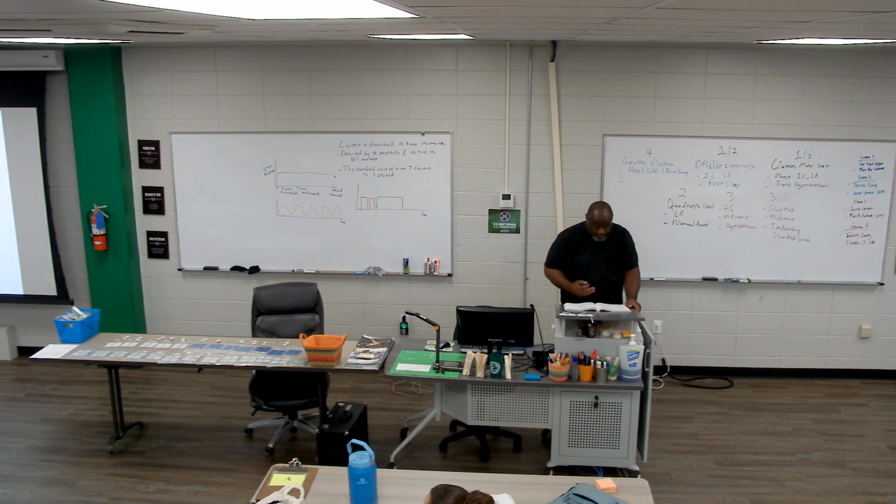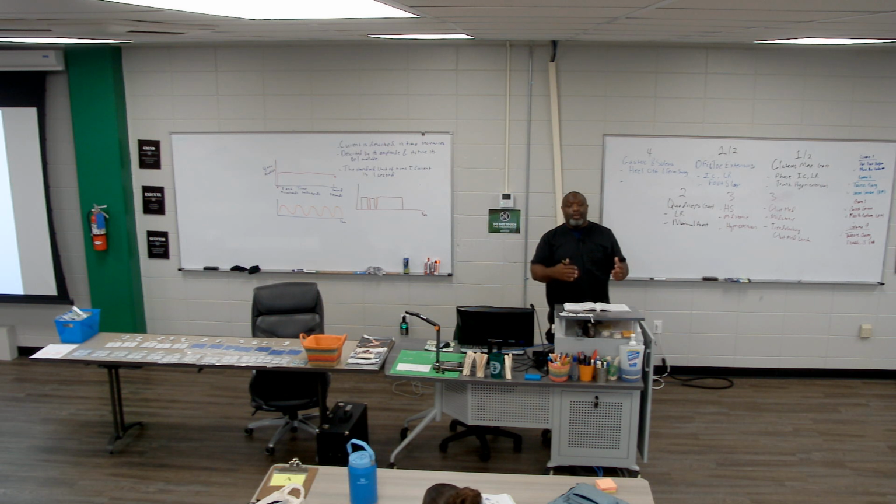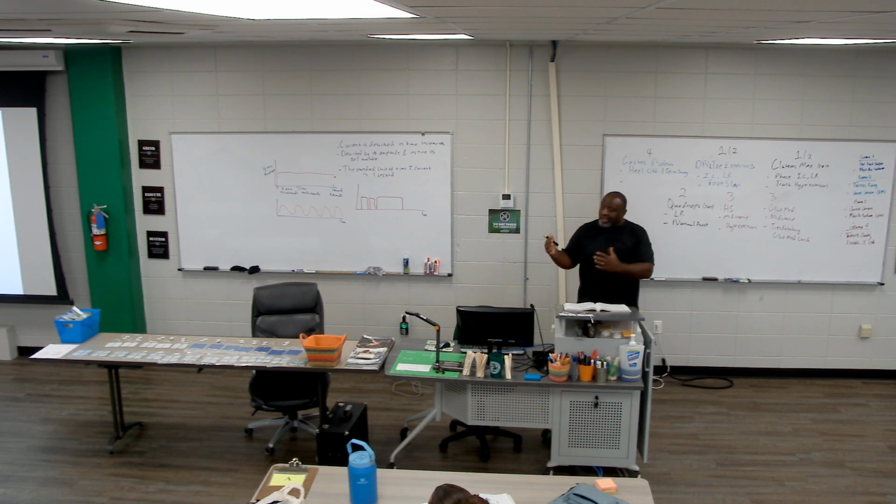So pre-select. Down underneath that, it says waveforms are diagrammatic only and rarely reflect what the patient is actually experiencing. So the patient is just going to experience the current. It may be preset to do these, but they're not going to feel it that way. They're just going to feel electrical current. We choose them based on what goal we're trying to accomplish. So different waveforms accomplish different objectives.